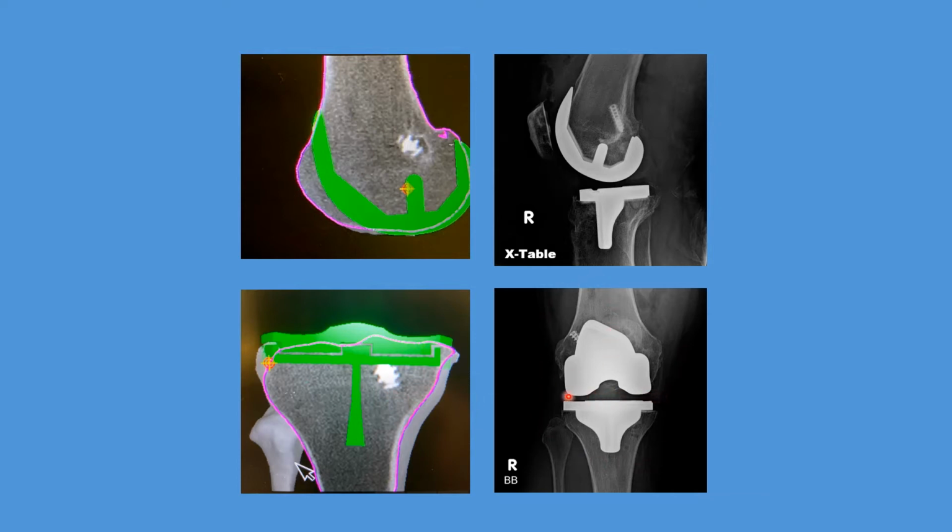And at the end, we can see our knee replacement looks exactly as we had planned. We resolved the arthritis. There's a nice space in between the bones. And we restored the architecture where the femur and tibia are aligned. This femoral screw was never in the way. We left it alone. The tibial screw was in the way, had to be removed, and so we removed it. Let's take a look at another example of fixation.